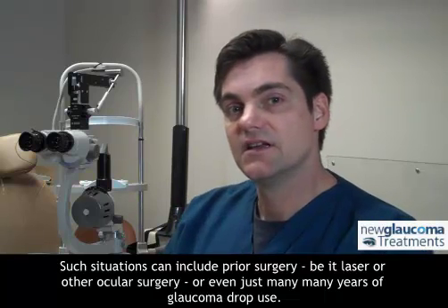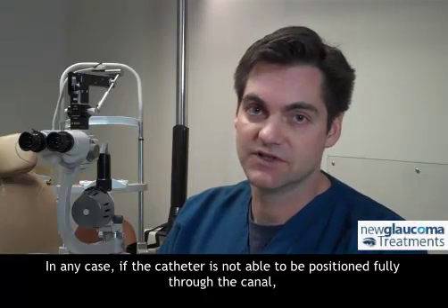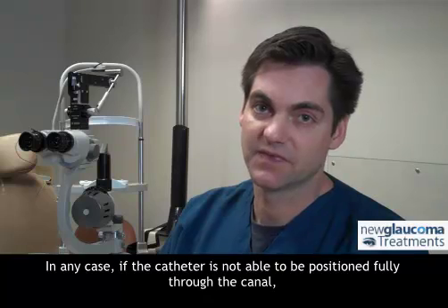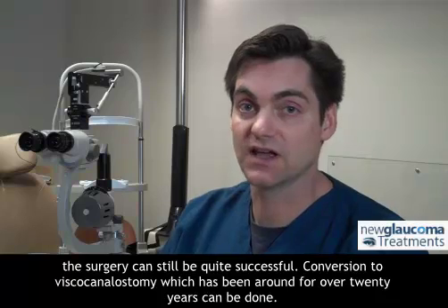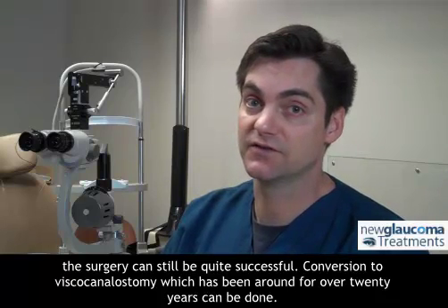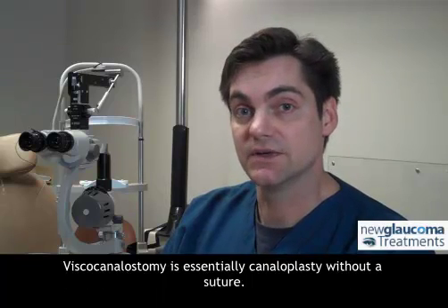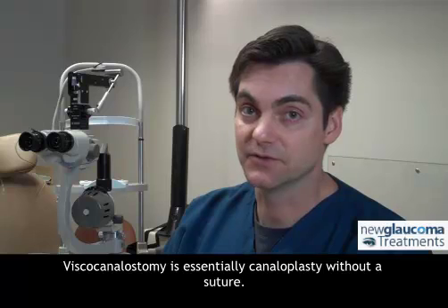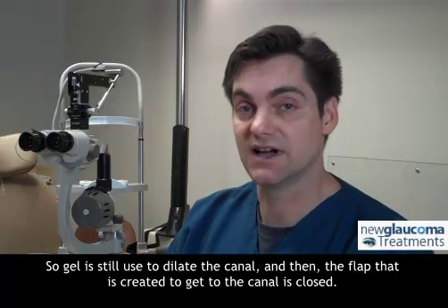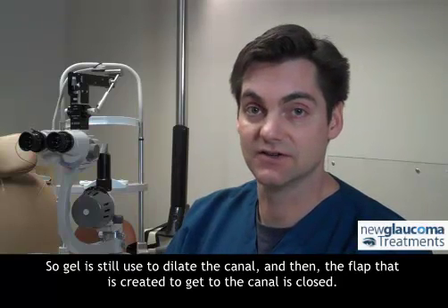In any case, if the catheter is not able to be positioned fully through the canal, the surgery can still be quite successful. Conversion to viscocanalostomy, which has been around for over 20 years, can be done. Viscocanalostomy is essentially canaloplasty without the suture — a gel is still used to dilate the canal, and then the flap that is created to get to the canal is closed.